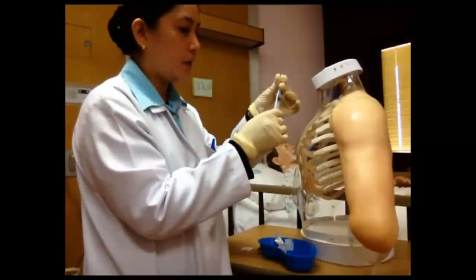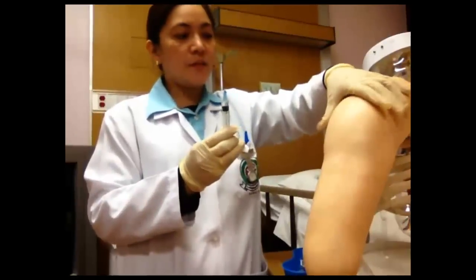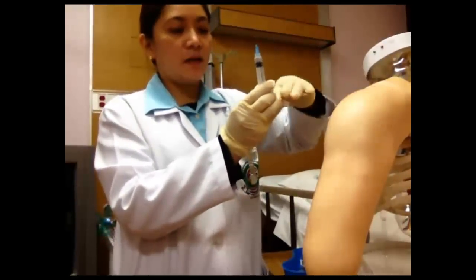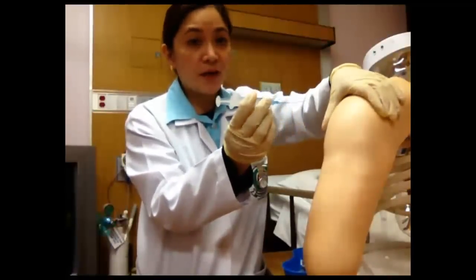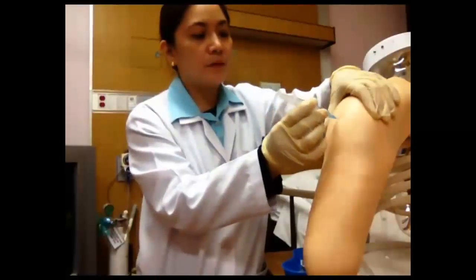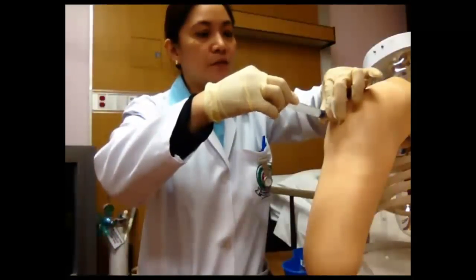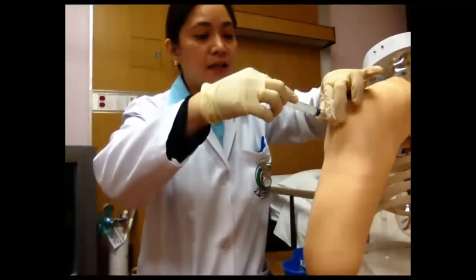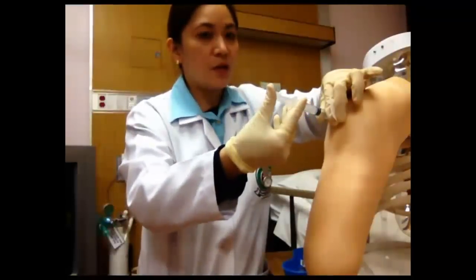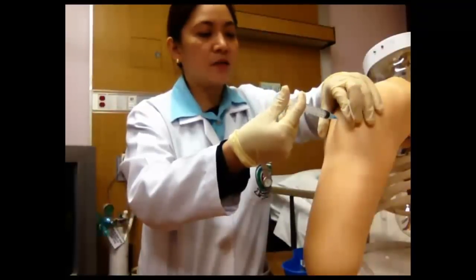As for the correct medication, remove the cover, and make sure that there is no air. Pinch the muscle of the patient and inject in a dart motion, at a 90 degrees angle, quick and dart motion. Then hold it and aspirate the plunger. Check if there is blood from the medication or coming from the patient's muscle. If there is no blood, meaning you did not hit any vein, and it is safe to inject the medication. So, push the plunger slowly and give the medication to your patient.